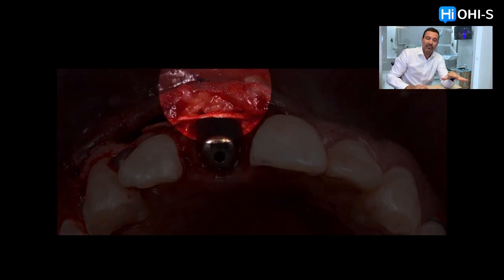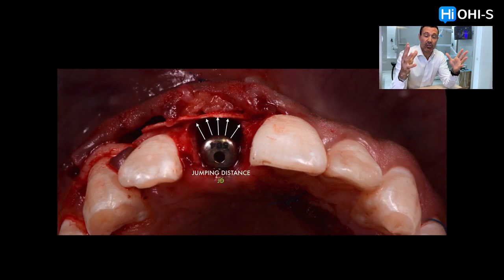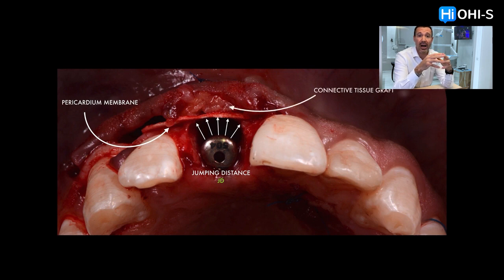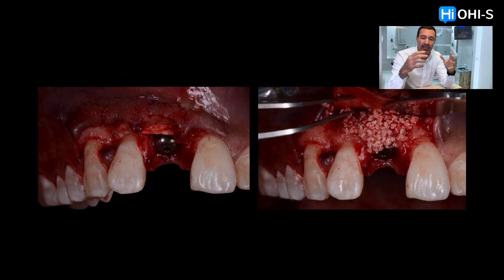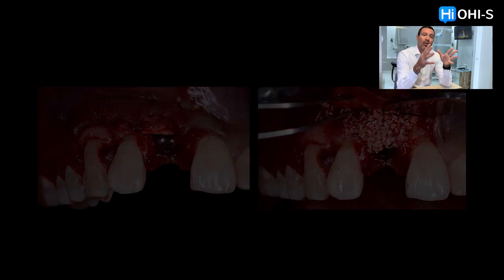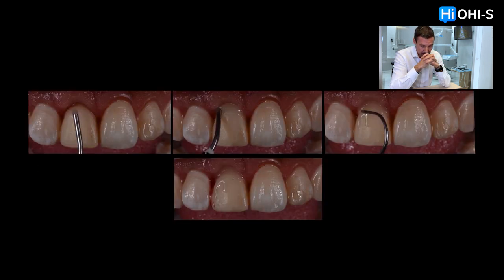The socket type classification and sub-classification. Sometimes we have the typical classification, but classifications evolve over the years depending on how the technique has been evolving and how it has been shared by clinicians who publish amazing articles. So it's not only about the classification, but also the sub-classification of the cases.